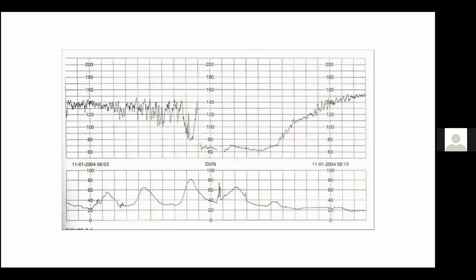Okay, so we can type on the chat, what do you think will be the causes of these single prolonged decelerations? So we can see here, because this CTG is running at 2 centimeters, we're seeing almost 4.5 minutes of a deceleration after a normal good variability. So when you see a single prolonged decel, you must ask yourself, what is the insult?